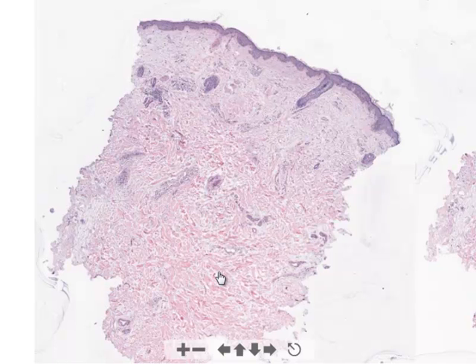This leads us to two diagnoses, one of which is dermatomyositis. The other diagnosis to consider for this specimen is lupus erythematosus. With lupus erythematosus, you typically see more pronounced vacuolar changes along the dermal-epidermal junction. In addition, there may also be a more pronounced flattening of the epidermis so that the ridge pattern is not as intact as one might see in this particular instance.